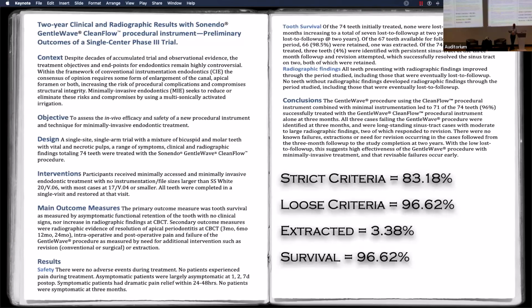So the question was, do I do patency checks when I'm using rotary files? And the answer is sometimes, and it depends. Do I feel like I have an increased chance of getting blocked out? Yeah, I'm going to do patency checks. But also, I'm using files that are around the size of hand files now, the 1002. And so maybe the 10 goes and the 15 doesn't go, and the 15 kind of doesn't want to go. So I'll pick up the 1002 and I'll use that rotary file as my patency file check. That goes, we're done. I'm back to the 15. If that doesn't go, now I need to pick up the 10 hand file and try to figure out what happened.